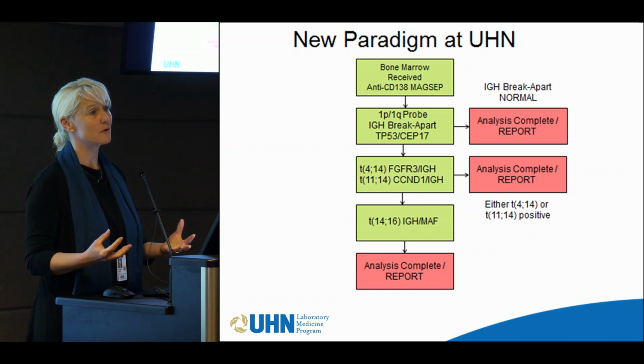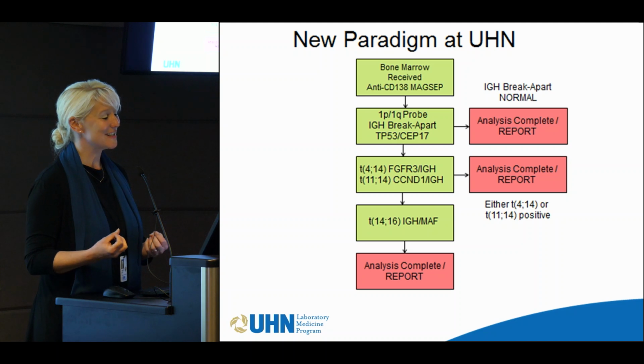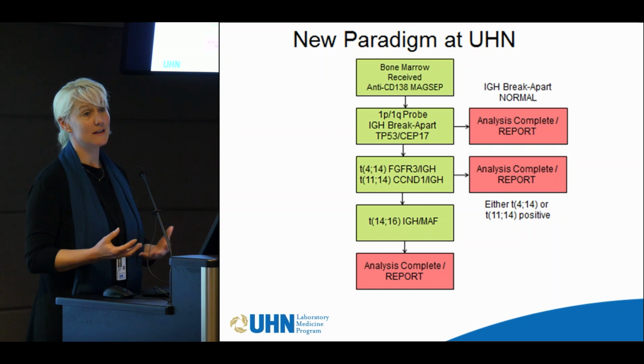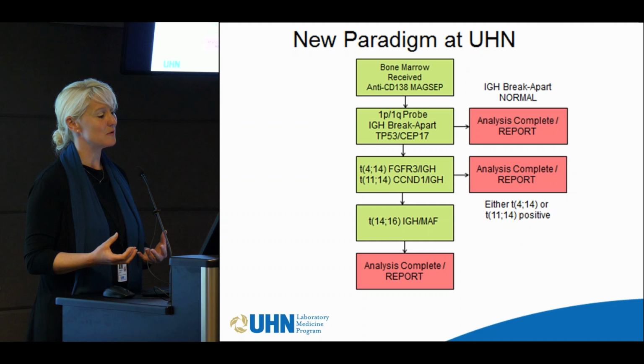We have 3 FISH probes that we do initially: IgH break apart, P53 deletion, and 1p, 1q, and these are high-risk cytogenetic abnormalities.